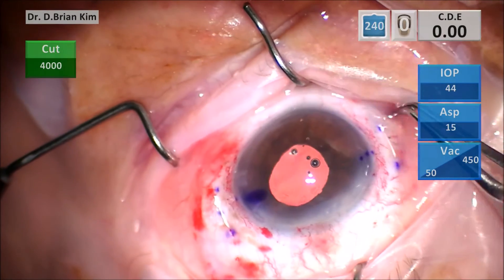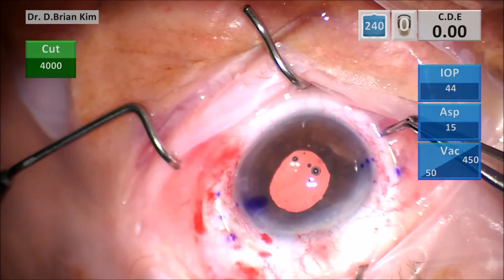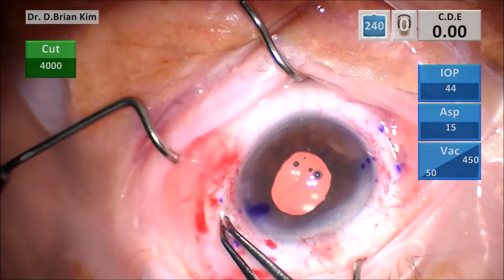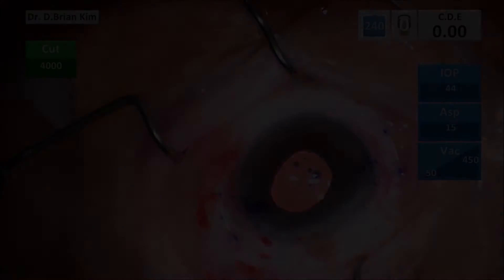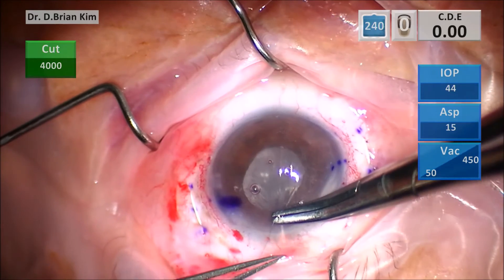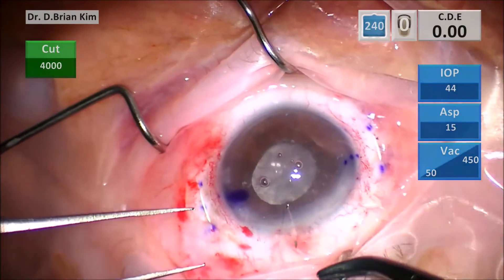I tied the sutures and buried the knot through the sclerotomies. I thought it was going to be difficult to bury that knot, but if you push down over the sclerotomy opening with your forceps, the knot pops in very easily without any difficulty. I'm closing the main incision with 10-0 nylon suture, and I do that twice here just to ensure a good seal.